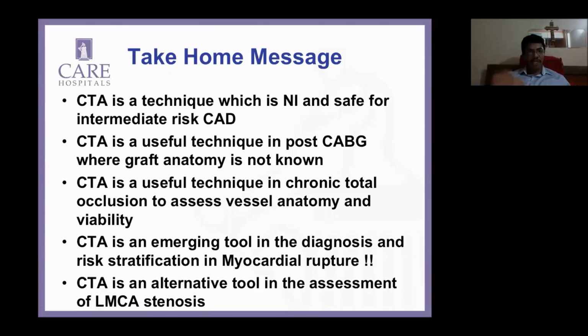And I'm getting the wall motion, the function, and viability as well. Now, viability is not good with a 64 slice scanner. It's almost impossible. You need to have dual energy capability, either with a single source or with dual source. We have a dual source, dual energy. So viability is not a major problem for us in just a single run. But anybody working with anything less than that, I wouldn't even attempt looking at viability.